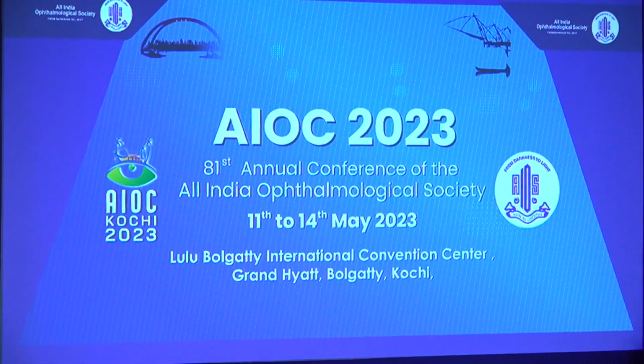Our next speaker is Dr. PRASHANT BAWANKULE. We already had the brief introduction about the wide field imaging and everything. So I would be speaking on why we should have a wide field imaging. Is it just an additional privilege like owning a Mercedes, or is it a necessity in today's day-to-day clinical practice?